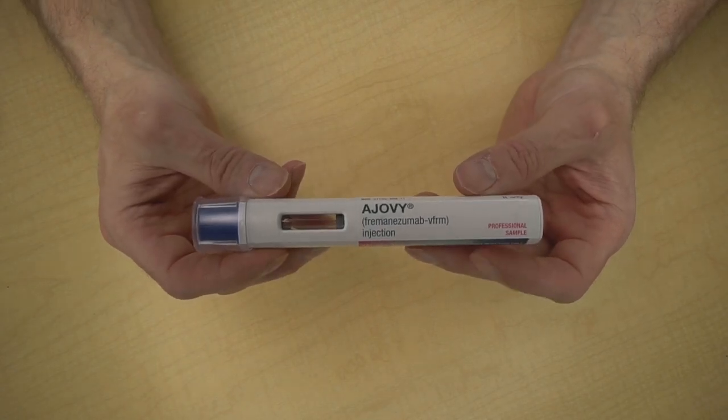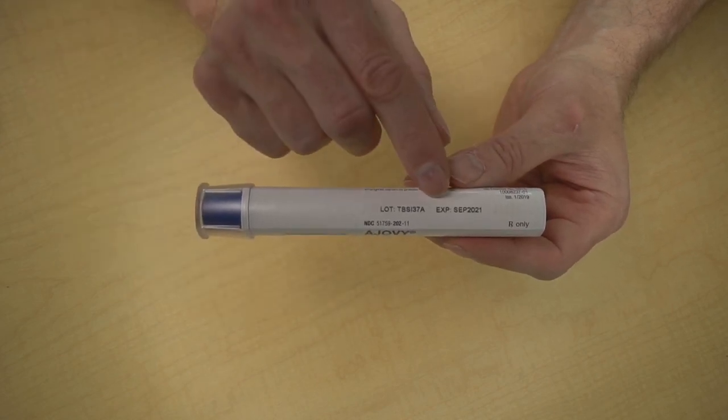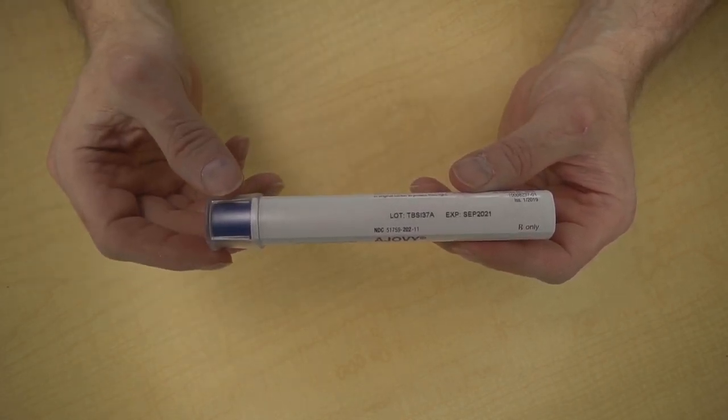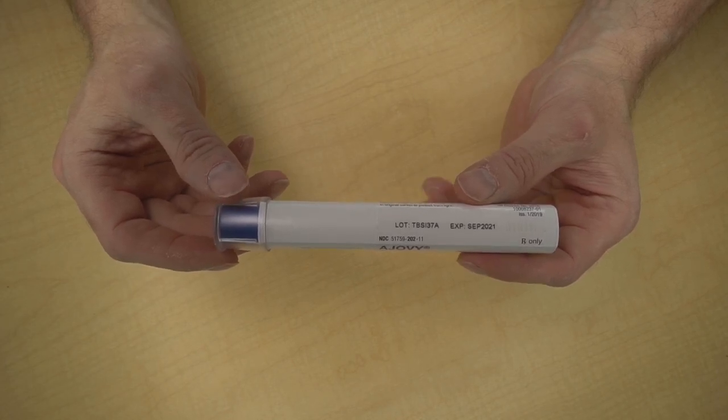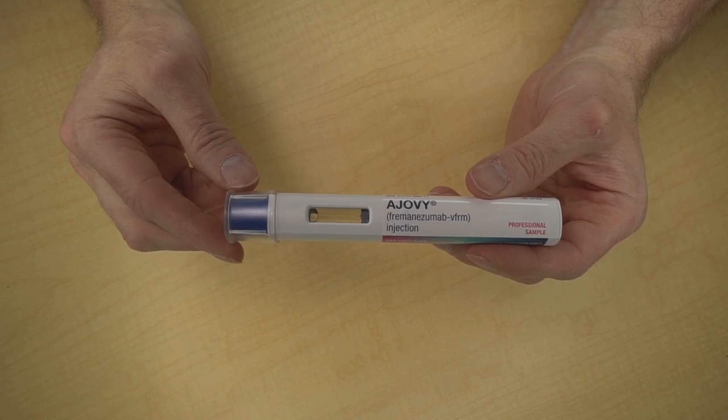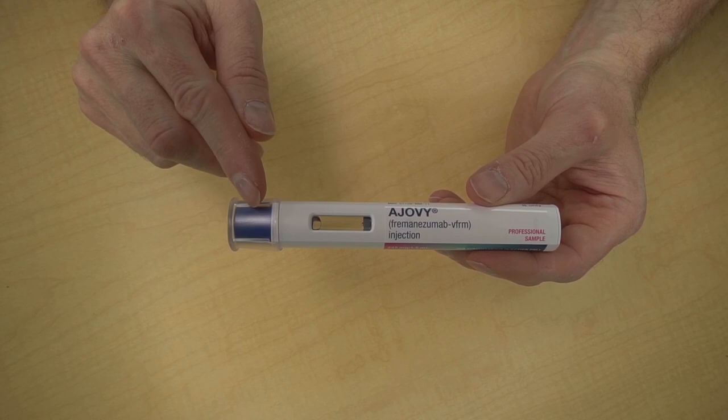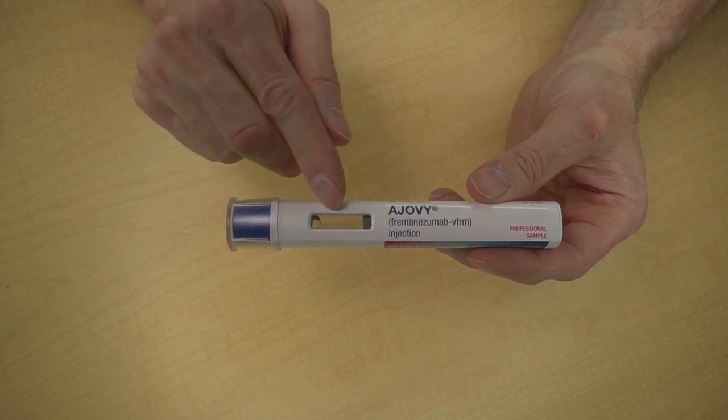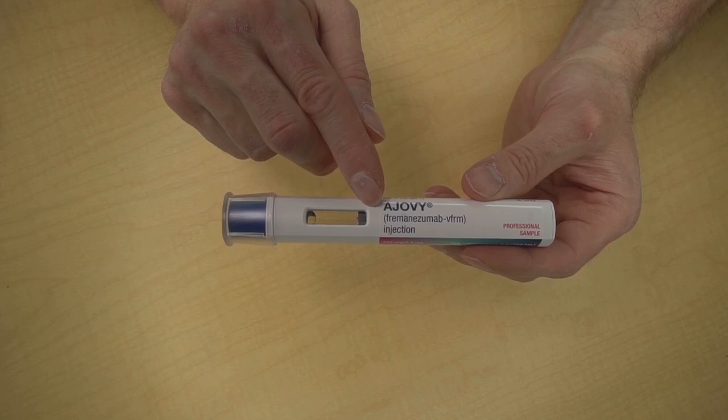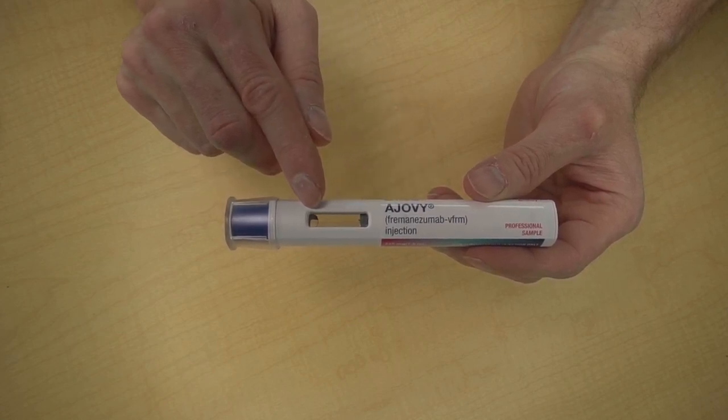Let's take a closer look at the Ajovi auto-injector. First of all, make sure it says Ajovi. Next, check the expiration date. In this case, it's September 2021. Don't inject expired medicine. This is the clear protective cap. You're going to remove the protective cap just before you inject the Ajovi. Underneath the protective cap is the blue needle shield. This is the viewing window. This is a gray stopper and it's attached to a blue plunger and it will move across the viewing window as you inject the Ajovi.